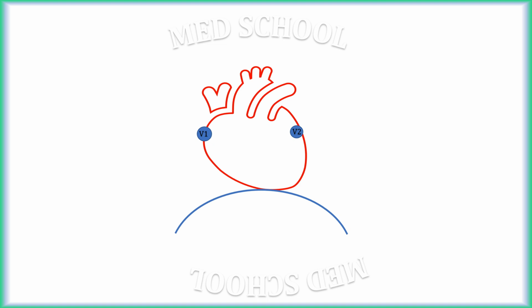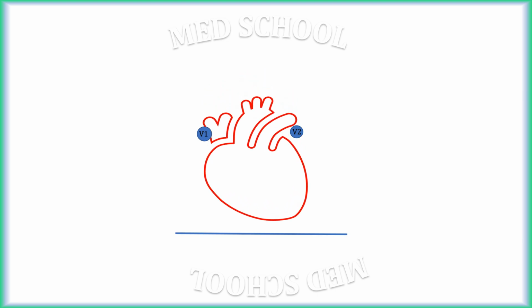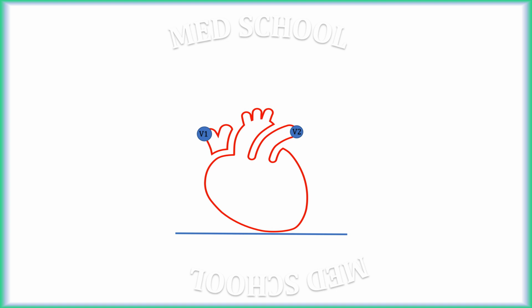In cases of COPD, there is hyperinflation of lungs, which makes dome of diaphragm flat, and heart is shifted downward. As discussed in basics of ECG, negative pole of precordial lead is at center of heart. That's why this shift of heart also changes orientation of lead axis of both lead V1 and V2. Moreover, P wave axis is often deviated toward 90 degrees, which makes P wave axis going away from V1 and V2 electrode. Hence, there is prominent negative deflection in lead V1 and V2.